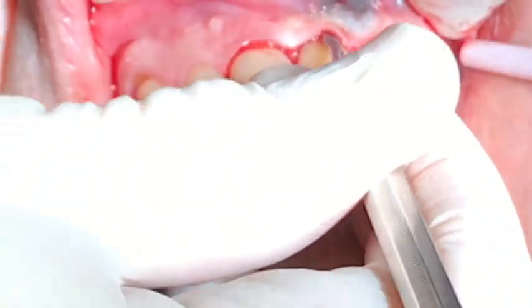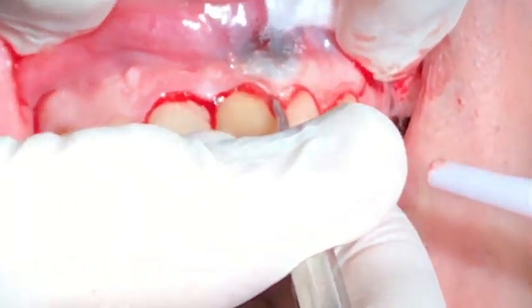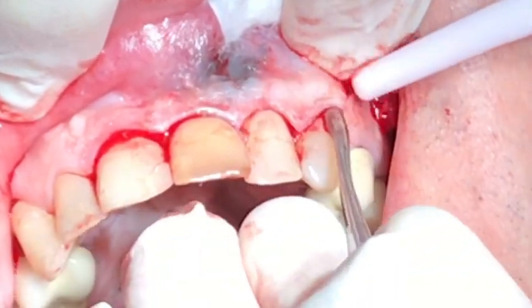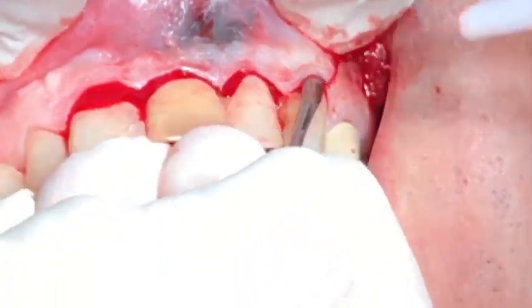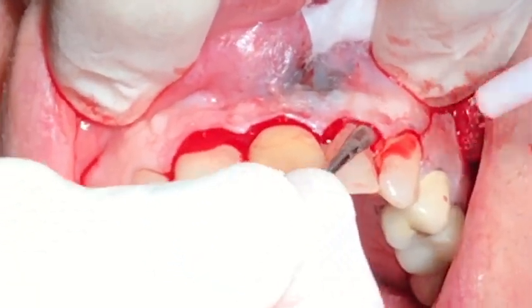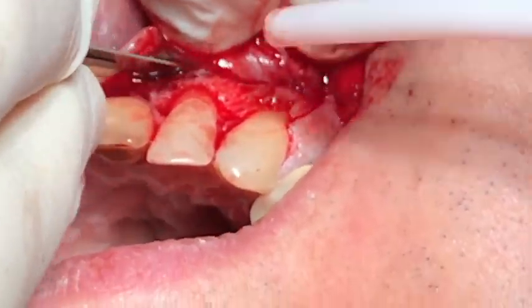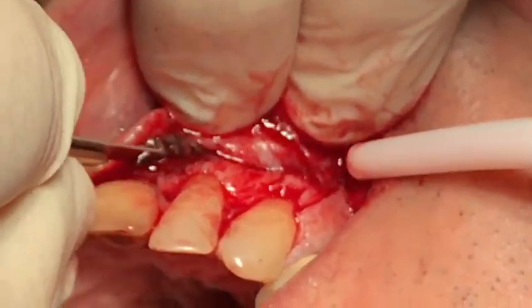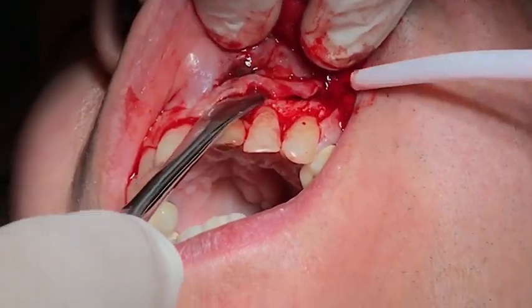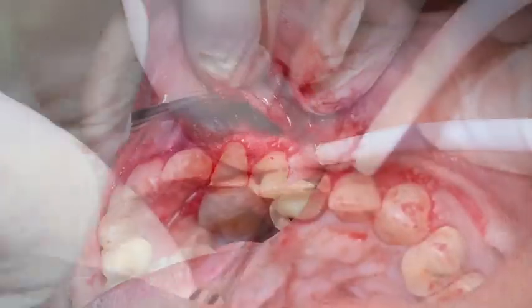A full thickness flap was elevated. It was started using the point tip of a Woodson plastic filling instrument. In the area over the central incisors, sharp dissection was needed as there is extensive soft tissue. Here we continue to raise the flap.